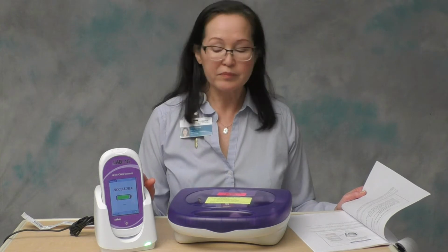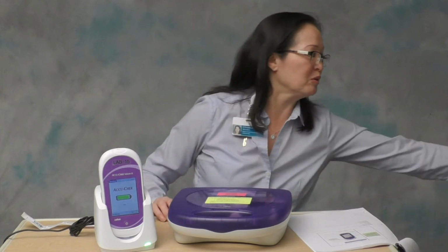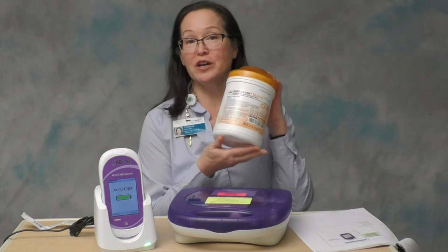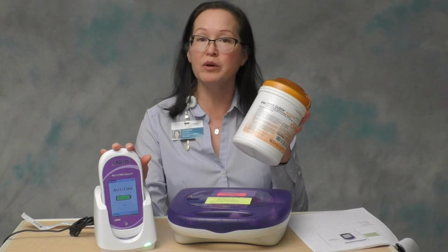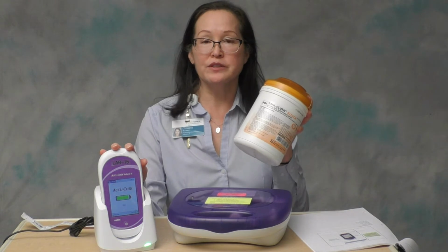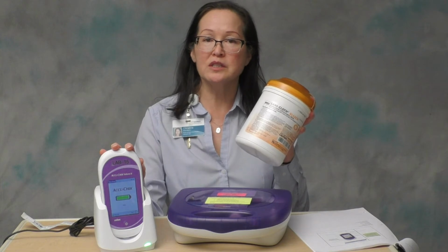These instruments need to be disinfected with the Sani-Cloth bleach germicidal wipes, which I'm just going to reach for. The wipes in the tub with the orange lid. We require the use of the bleach wipes in our facility because this is shared medical equipment that goes from one patient room to the next, and our facility being an inpatient facility, we often have to deal with C. difficile infections.